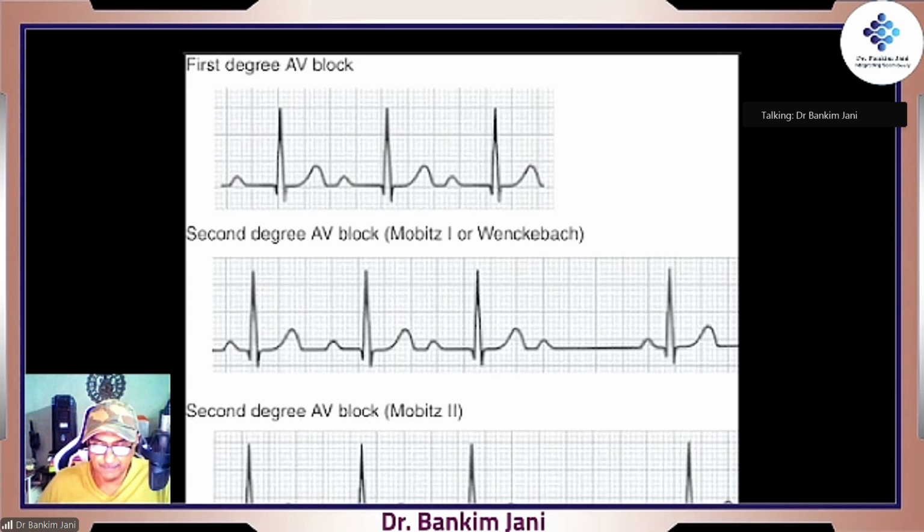See this. This is for a very good clarity. Here to here, first degree AV block. So here to here. Yes, it is more than one big box. It is more than 200 milliseconds. Right? So we are talking about first degree AV block.